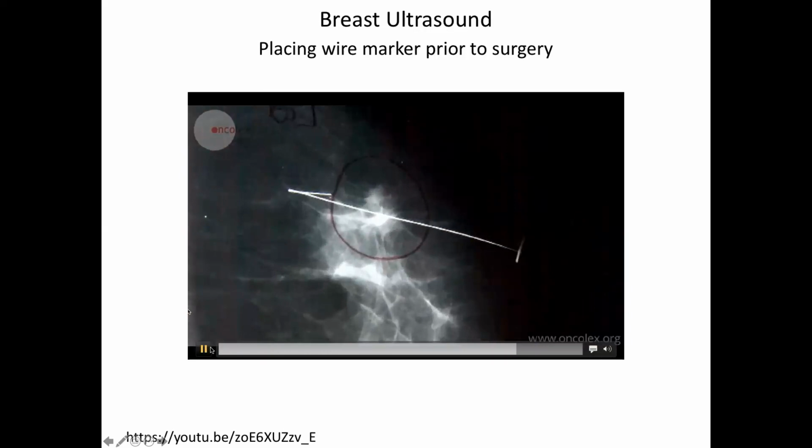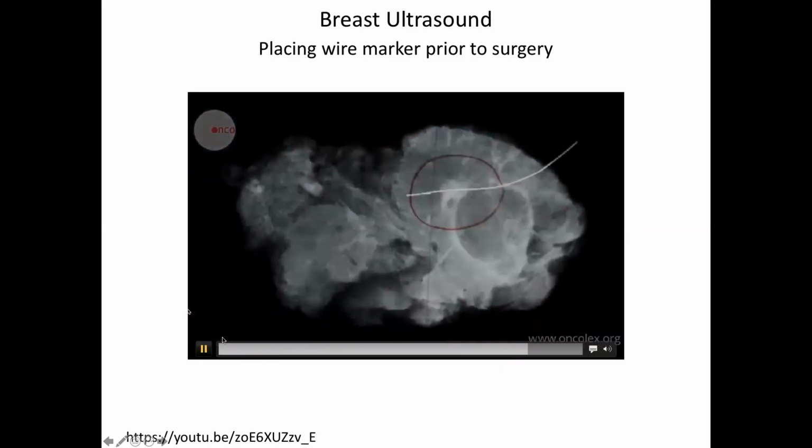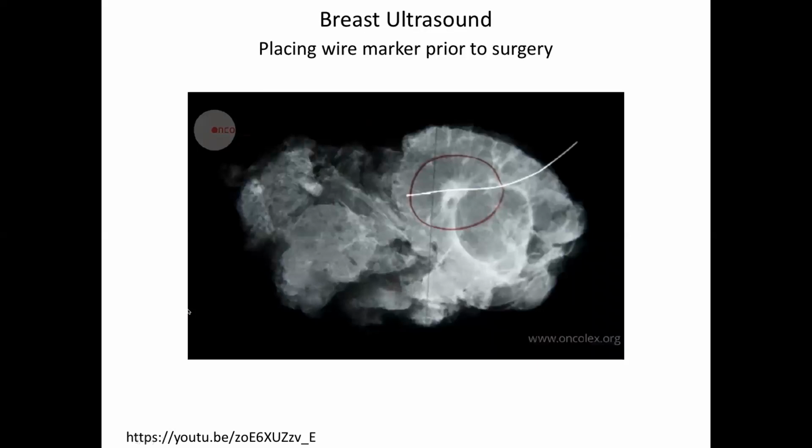And the surgeon, when they go in to resect it, they resect, I don't know, a couple of square centimeters or something, and you can confirm that the tumor and the wire and everything came out the right spot by just x-raying what was resected, right? So that's ultrasound to just nail where you should go in there if you're doing that kind of surgery.